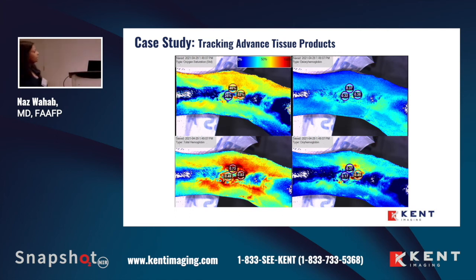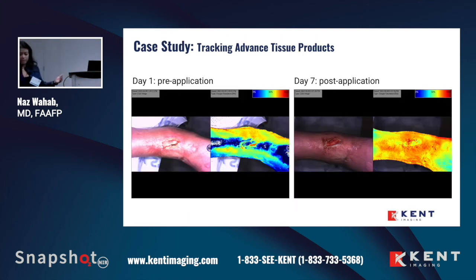And so what did that mean to me? Nonetheless, we started applying advanced products in hope of some recruitment of angiogenesis and recruitment of stem cells and whatnot, all of the great things that we think about when we're trying to do these interventions. And you can see here that post 7 days of an application of a product, and I'm not promoting any one product, you can see this with a variety of interventions, you went from this to this. And so there is movement occurring. And once again, justification of using those very expensive products.